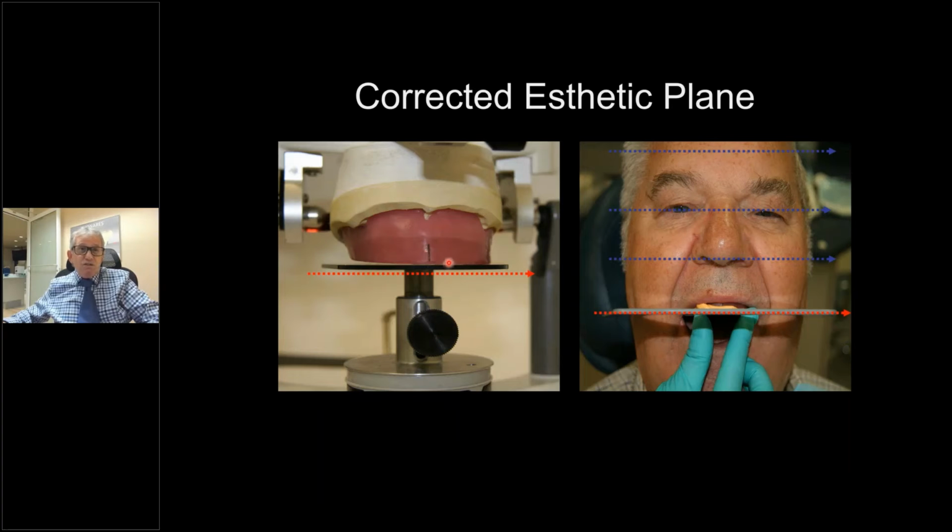Now, if you said, Don, I like the left side, we don't have to do anything. All Kelley Dental Lab will do, they'll set the central, the lateral, the canine. Over here, they will make sure to bring the central down farther than that occlusal rim, and the lateral down. Canine, first premolar, second premolar. Because this is your aesthetic plane here. It is not using the occlusal rim, because you did not try to reduce that. You gave us this nice bite registration here to straighten this up for us. So that is our new aesthetic plane.